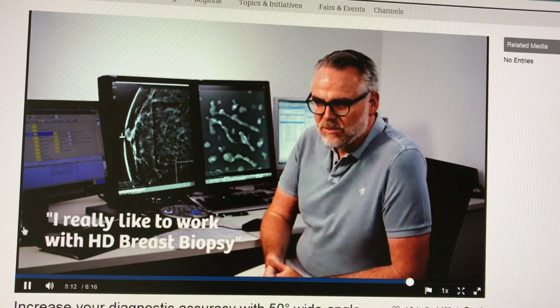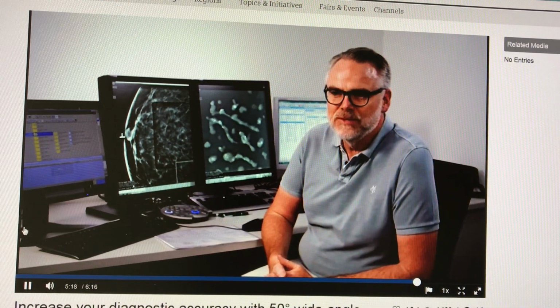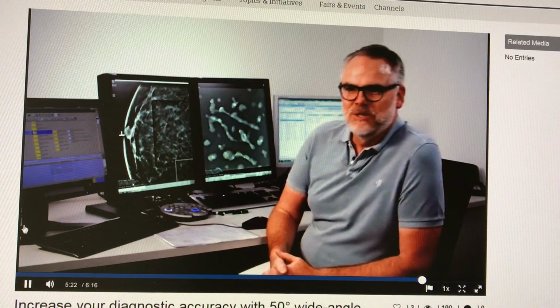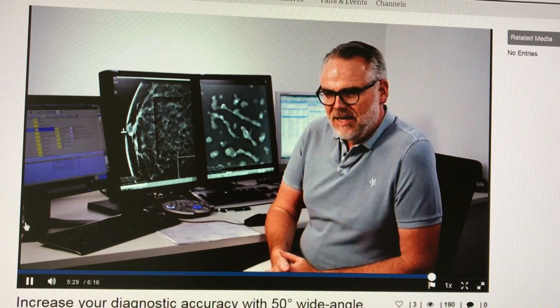I have come to really enjoy working with tomo biopsy, and I speak as someone with many years of experience using the prone table. That's why I found it a little difficult in the beginning to make the change to working with a new method.